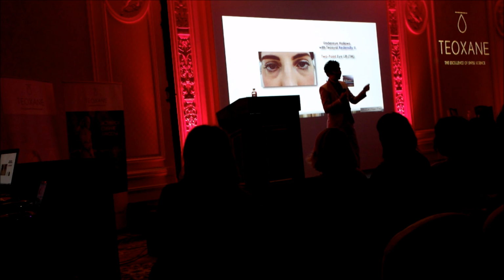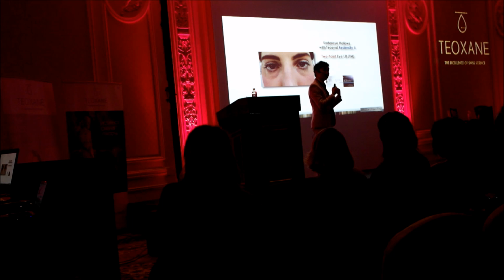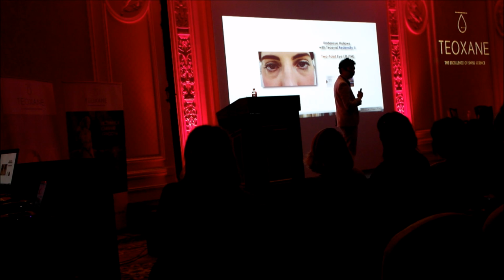Because the gunshot technique is simple. It's just straight down to the bone, but why are we so uneasy and uncomfortable about it? That's because we know that there are potential complications that can come with that procedure. So how do I do it well, and how do I do it so that I'm comfortable with the technique?